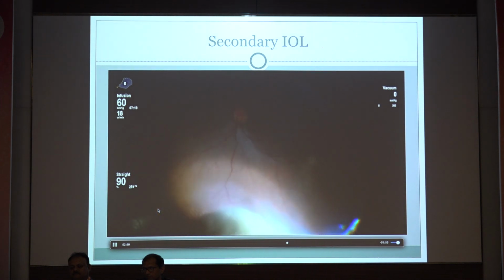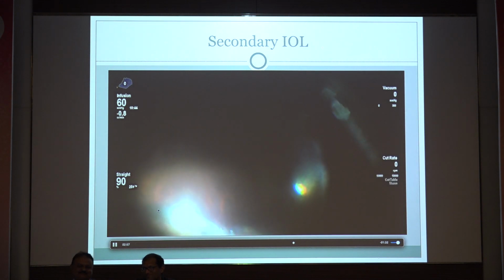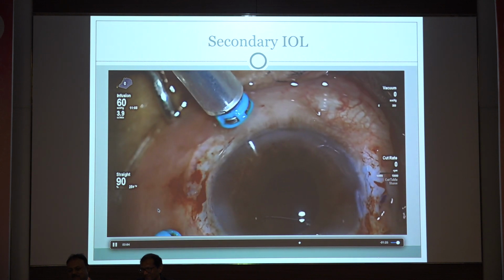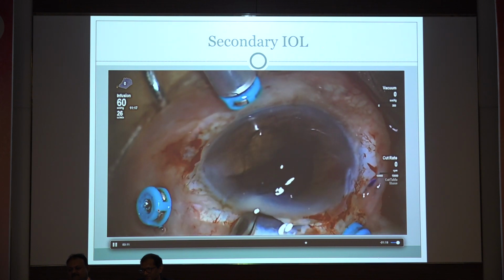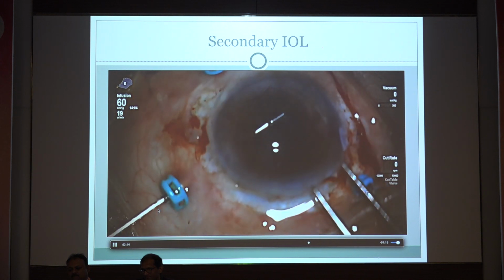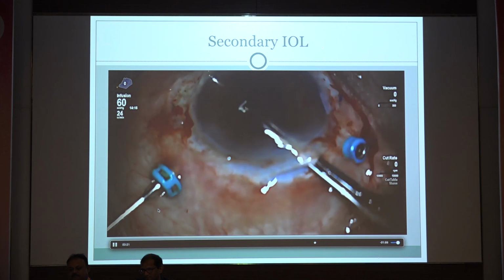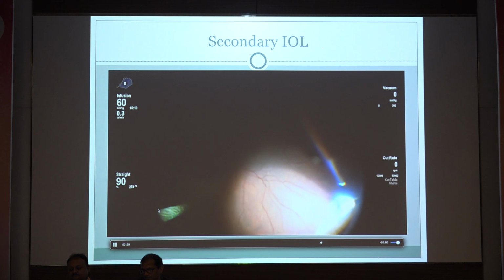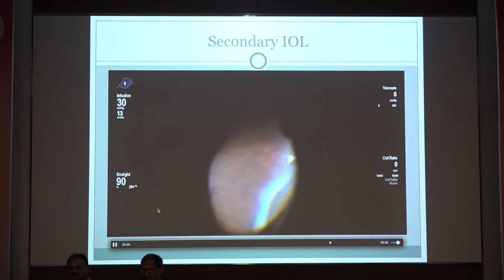While doing a peripheral vitrectomy with indentation, I saw a CTR. So a trial was made to remove the CTR, and the CTR was removed with a rotatory movement. So a complete vitrectomy was done. Even after 360-degree indentation, I could not find the broken end of the haptic, for which I actually started the pars plana vitrectomy.